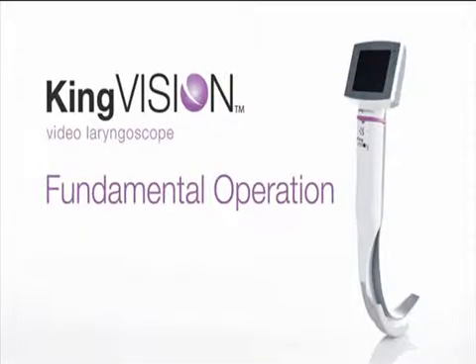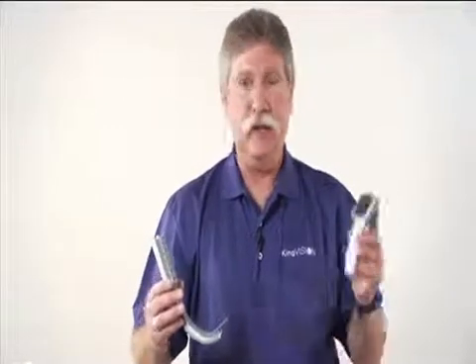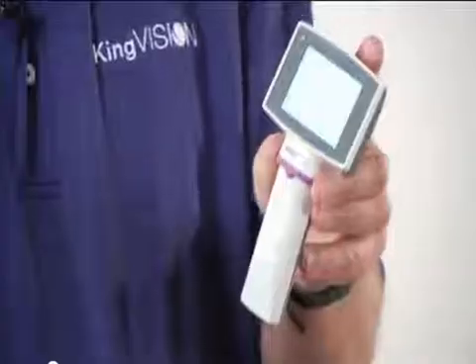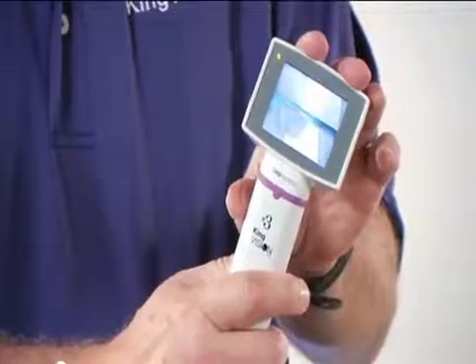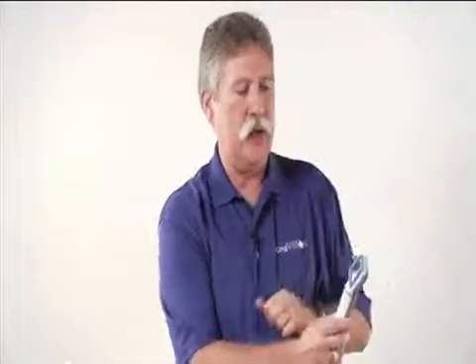In talking about the fundamental operation of the King Vision video laryngoscope, it's important to remember that because the imaging sensor is in the blade, you will not get an image on the display unless the two are connected before you power up. If you power up without the blade, you're not going to get an image. If you then attach the blade after the fact, you'll get a split image.